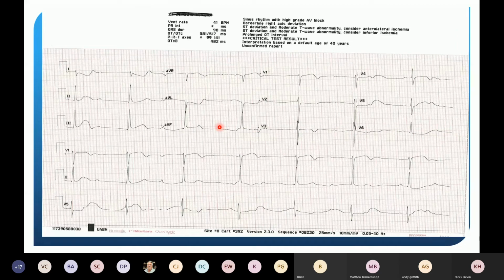All right, this one, too fast, too slow, or okay. Well, hang on. This is that. So same patient. This is the 12 lead from the hospital. So it's still way too slow. All right, but now we'll look at what we got. We got T-wave inversions in 1 and AVL and lateral. Those are more pronounced. But look at 2, 3 and AVF. What do we have there? We got elevation. Yeah.